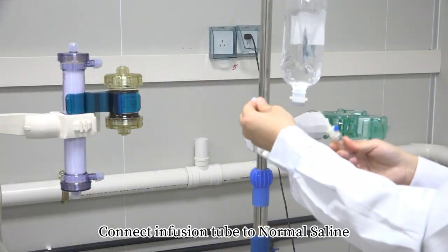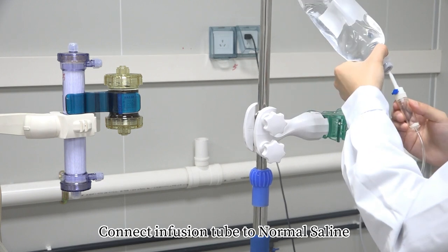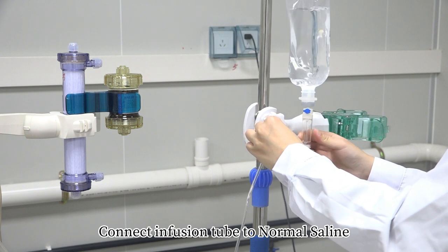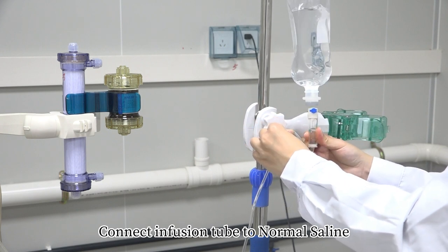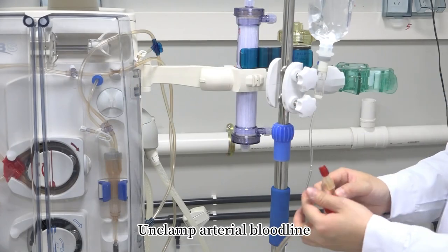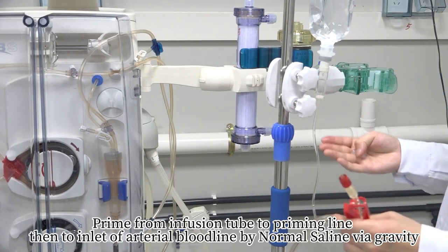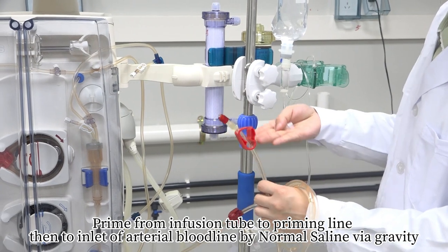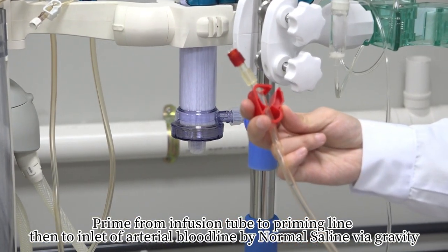Connect infusion tube to normal saline. Simply click on the left side of the tube. Prime from infusion tube to priming line, then to inlet of arterial bloodline by normal saline via gravity.